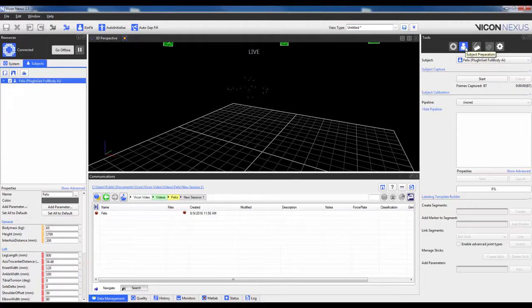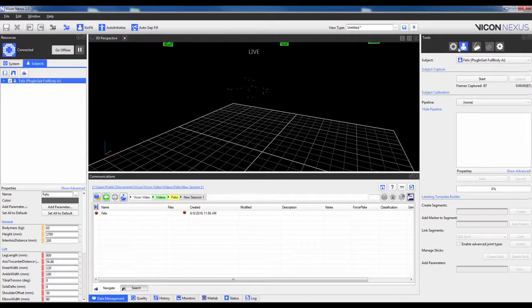In this example, I will capture from the Subject Preparation tab, and then show how this may be done later in the Data Capture tab.